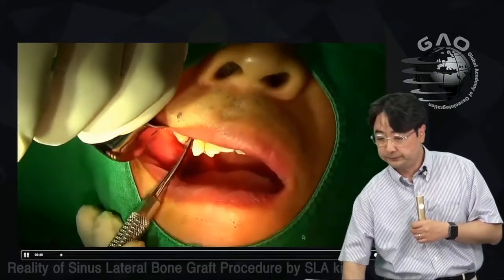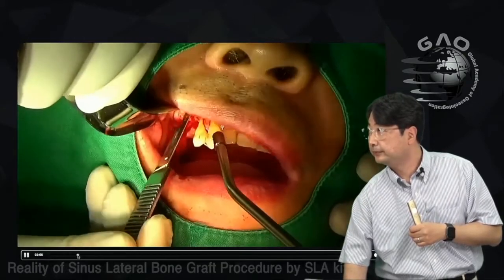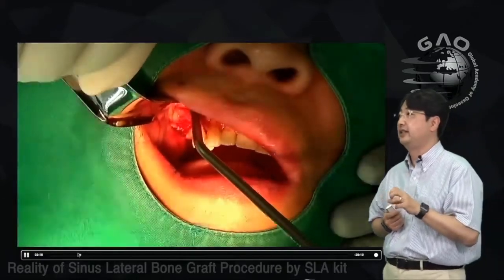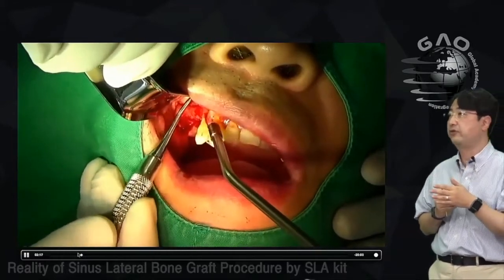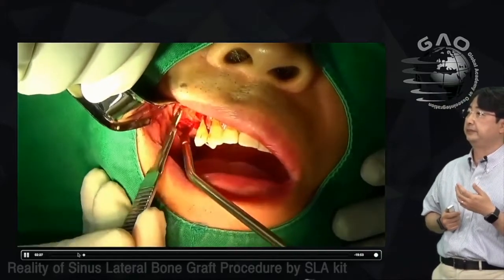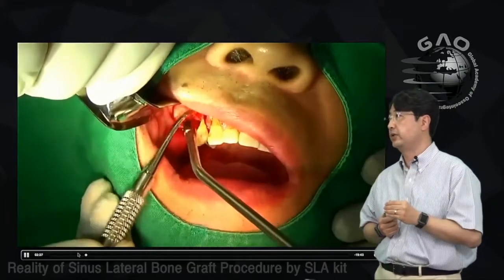Here you can see the attachments like scar tissue. I'm using a number 15c blade to dissect between the muscle and the periosteum, going little by little very slowly. You go very carefully to separate the muscle from the periosteum — one layer above — leaving the periosteum and the interior wall intact.